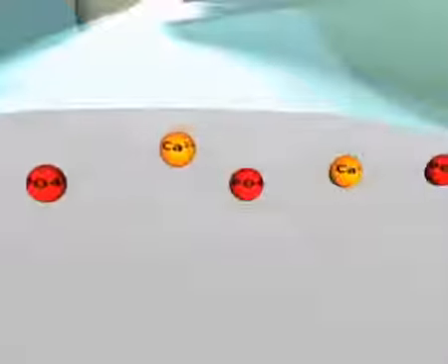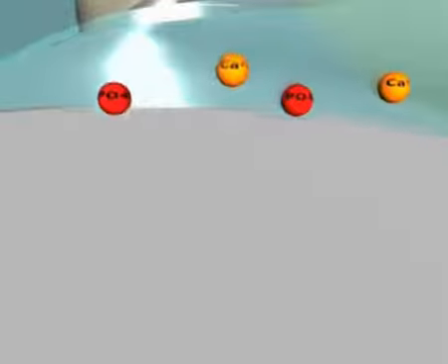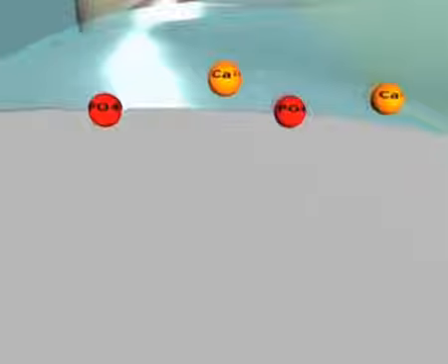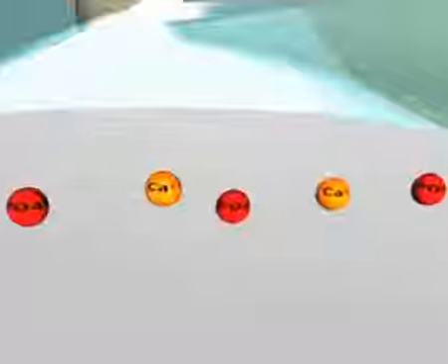Glass ionomer cements mature over time. However, their final strength is further enhanced by exposure to saliva after their initial setting reaction. Calcium and phosphate ions from saliva are able to penetrate into the set glass ionomer matrix, and this uptake further hardens the cement structure.